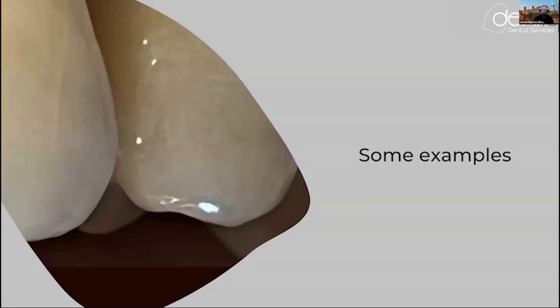This was a more complicated case. Unfortunately, I don't have a shade tab with this one, but we had to create a C color. And we all know a C color is one of the most difficult ones. Whatever we're going to make, even if it's a Zirconia or normal PMMA, it's difficult to get to. So what I've done, I've used a completely white resin, stained it up, and we got a beautiful matching C restoration.